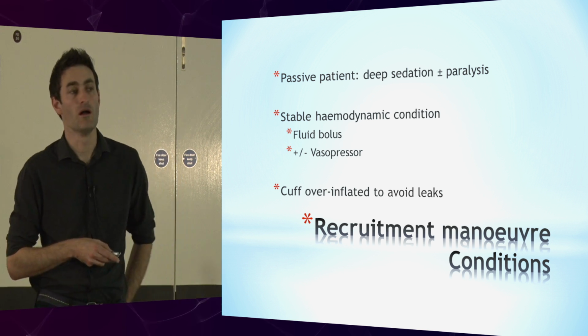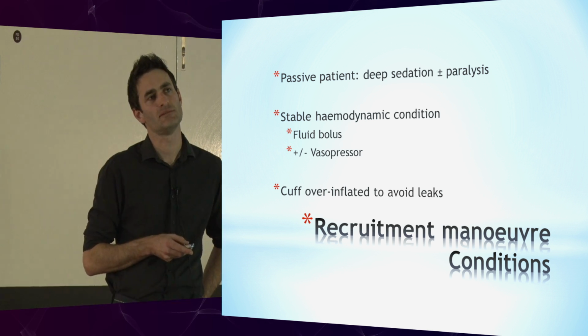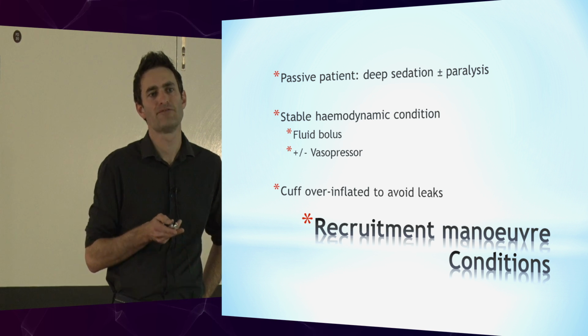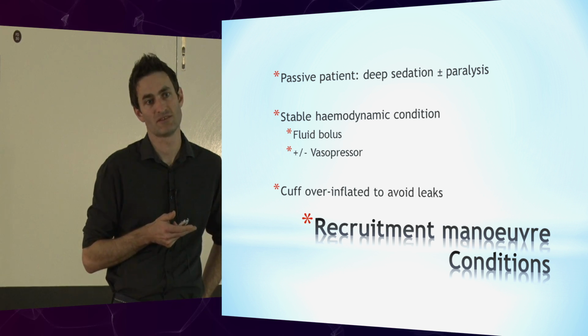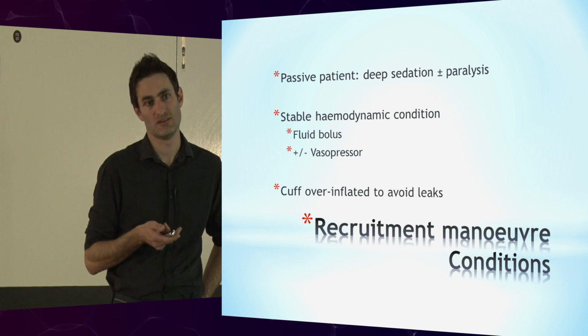Forever? Well, I suppose that's slightly difficult to answer, isn't it? I don't have evidence to give you for that. But I think the best way of looking at it is if you don't recruit the lung and don't use it for gas exchange, and keep it collapsed down, the less likely it is that you're going to have adequate gas exchange in the short term.